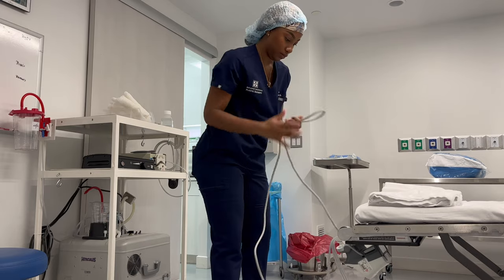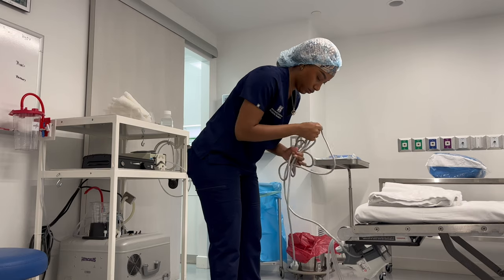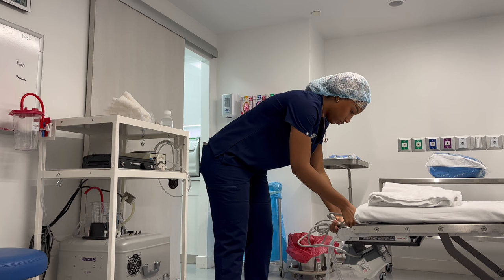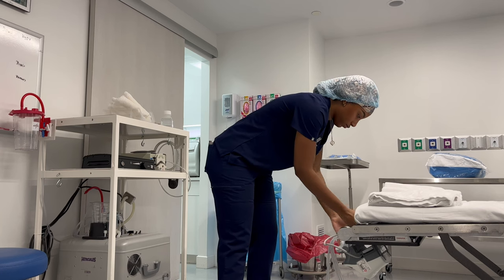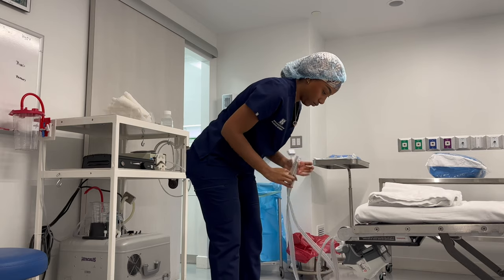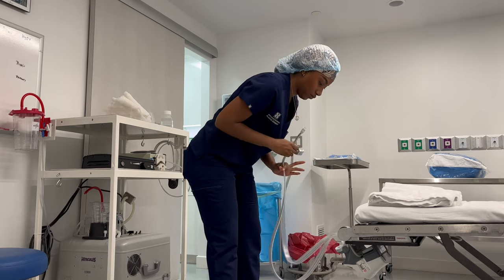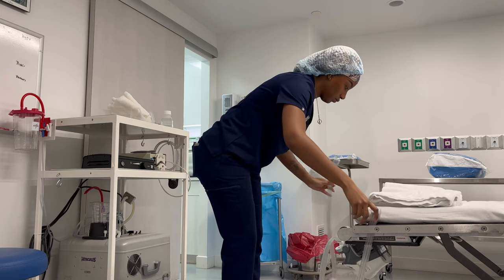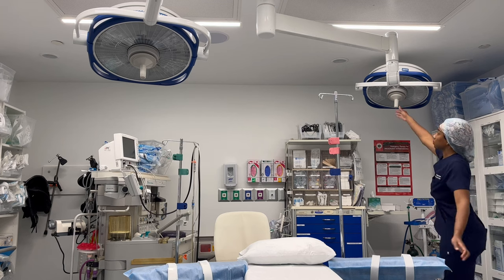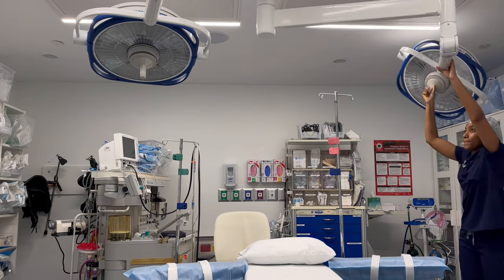So here I am in the room just getting everything ready. I'm getting the SCD machine, which is the sequential compression device, ready for the patient. When the patient comes in the room, that's on the bed, and we can just attach them to their squeezy booties. So I go ahead and get that ready. I basically use this time to get the room ready at this point. Usually we start really early in the morning at about 7:30, but today the case was starting a little bit later, so I had a little bit more time on my hands. So I usually do a lot of this the day before.